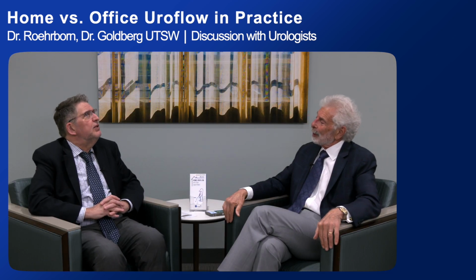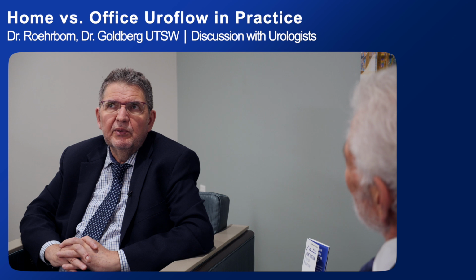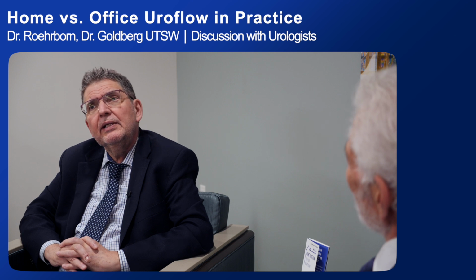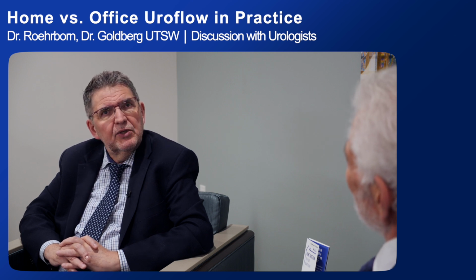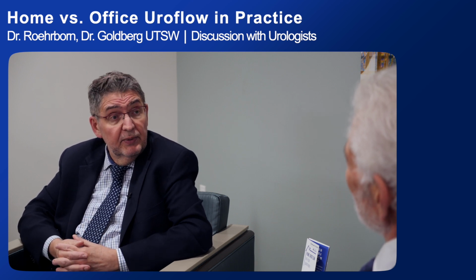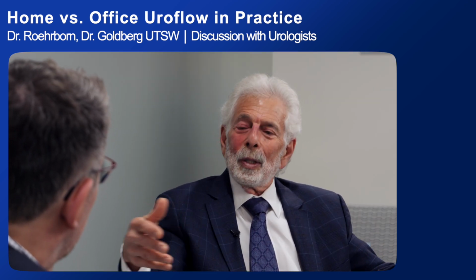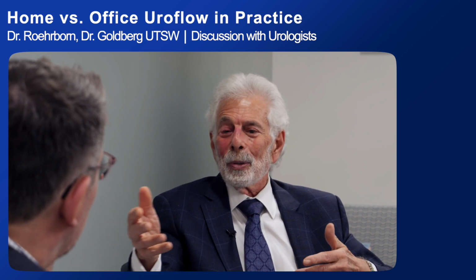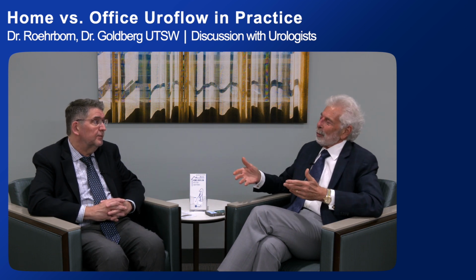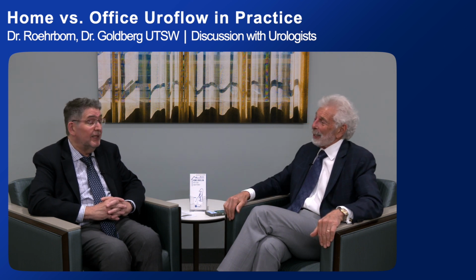Right. So if I would be a drug company and let's say I had an invention, a new drug for BPH or a new device for BPH, I might just say, let's do both, the in-office flow rate and the home flow rate, and see how my treatment influences either one of them, because it may also play a role in clinical research. Well, and you even mentioned that in the clinical trials that talked about alpha blockers, there was a change of just a couple, 1.5, 2 ml, it's not all that much. And when we stop and realize, well, if flow rate's variable, maybe we hit it the wrong way. Yeah, on that day. On that day in the clinic.